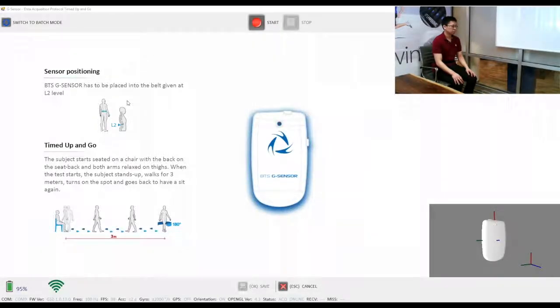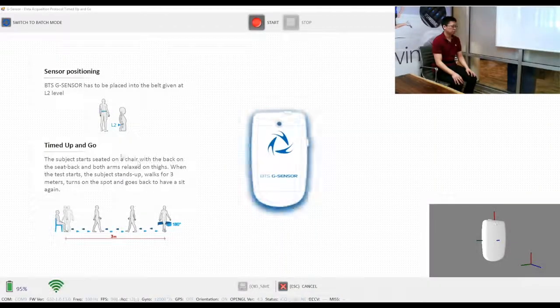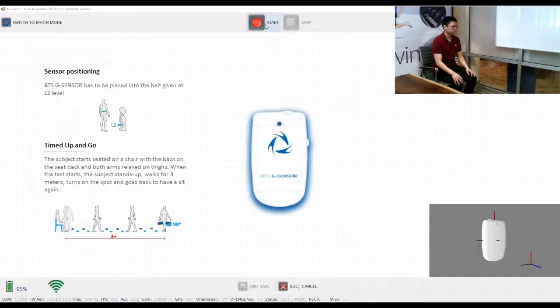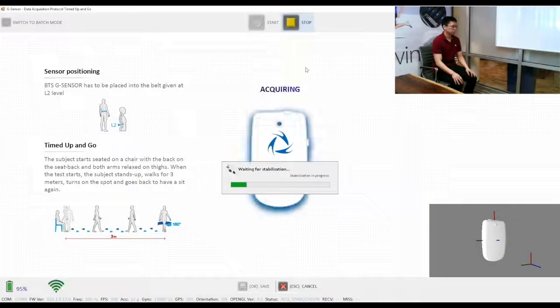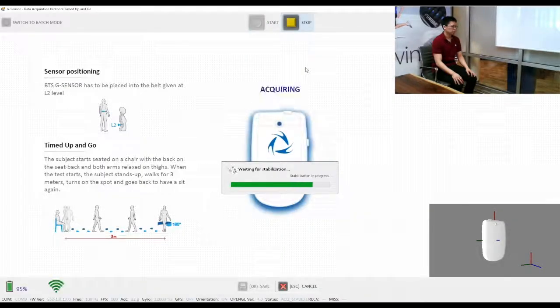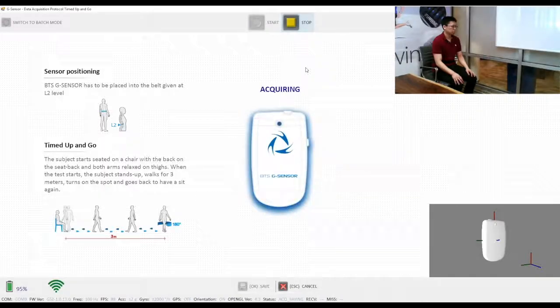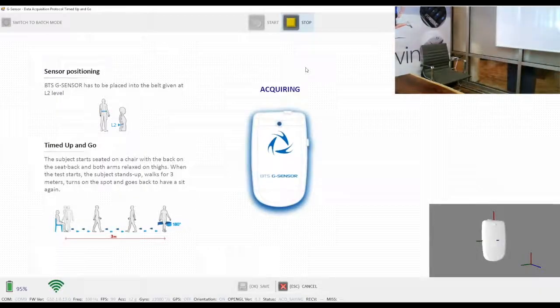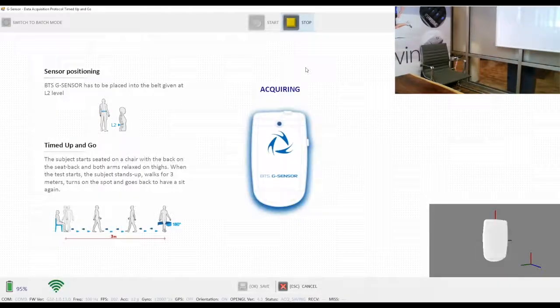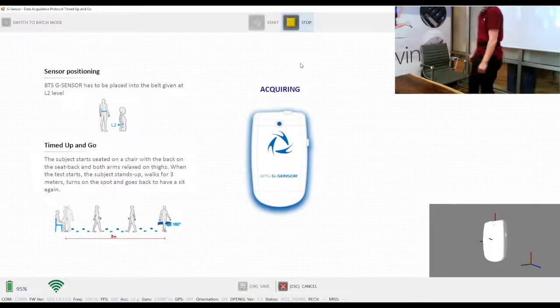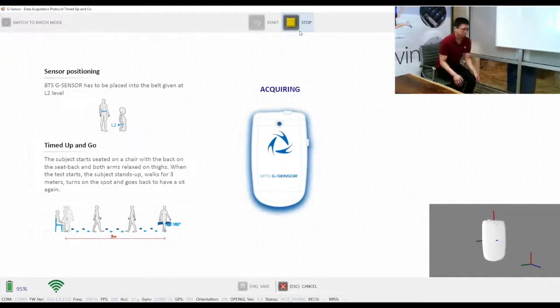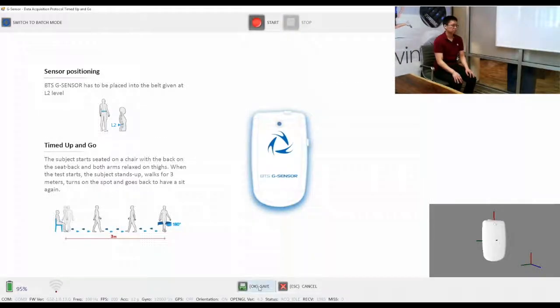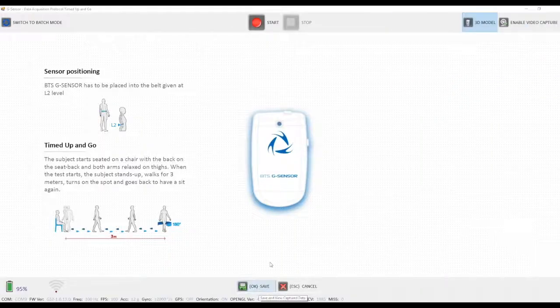As you can see in the acquisition screen, on the left side there's a description of the sensor placement and brief description of how to perform the test. We will now click start to begin the recording. After a brief moment of calibrating the sensor position, the subject will perform the test. Once they return to the seat, we'll click stop and save.